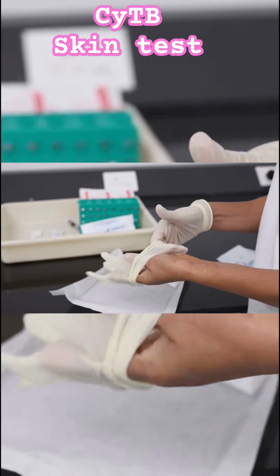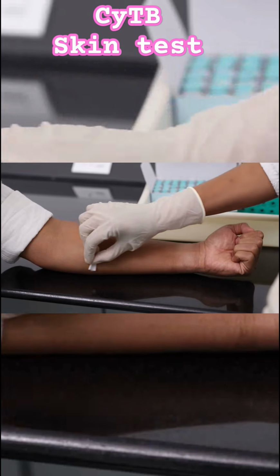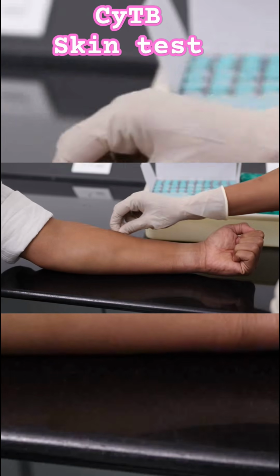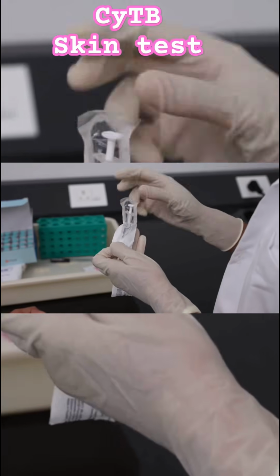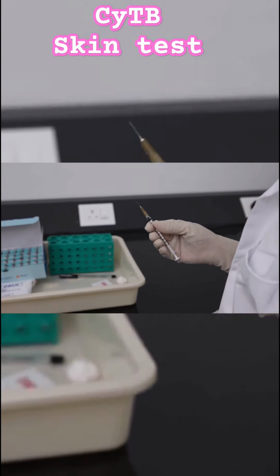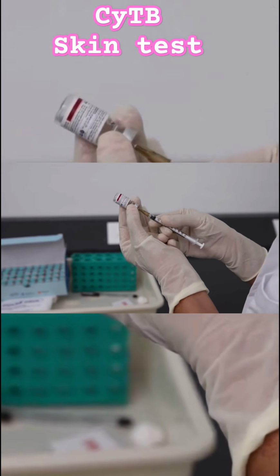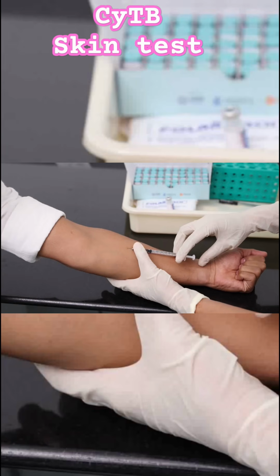The skin test for TB is to be given on the volar surface of the forearm. Cleanse the area with alcohol swab and allow the area to dry. CyTB is administered by injecting 0.1 ml of CyTB solution intradermally. The solution should be injected using a 26 gauge needle with a 1 ml syringe with the needle's bevel facing upwards. Hold syringe flange parallel to the forearm.